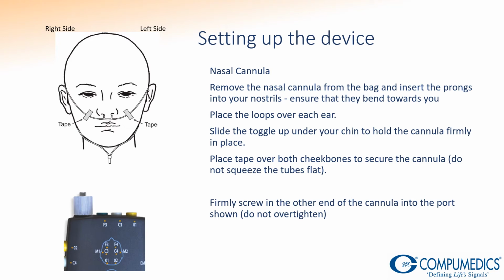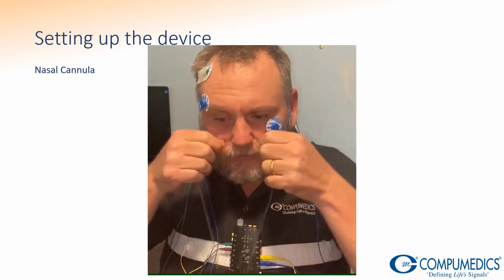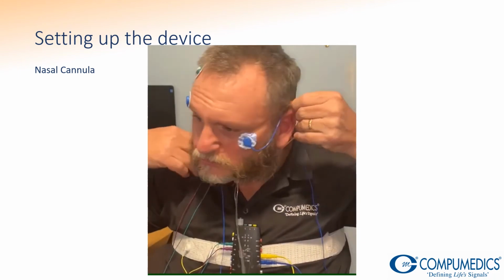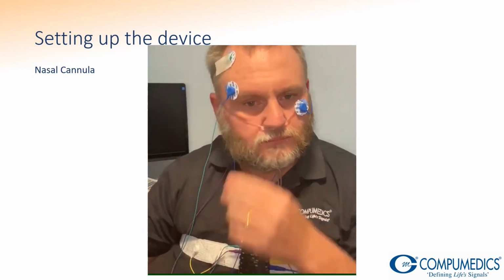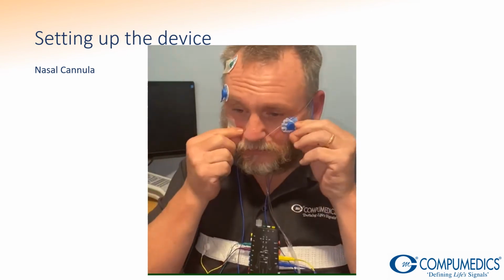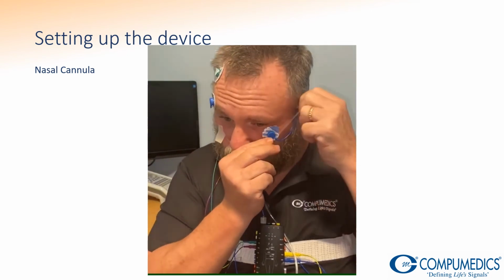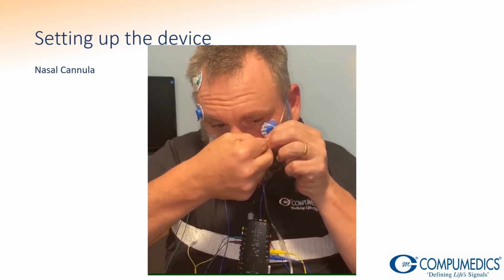Do not squeeze the tubes flat. Firmly screw in the other end of the cannula into the port shown. Please do not over tighten. Prior to placing tape, we recommend moving the cannula around to make it more comfortable, but to make sure it does not fall out overnight.